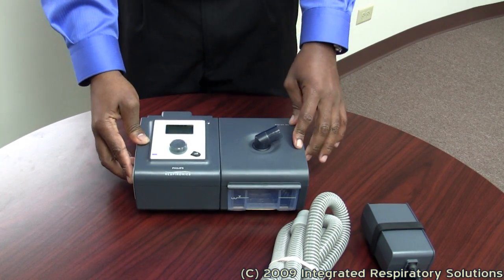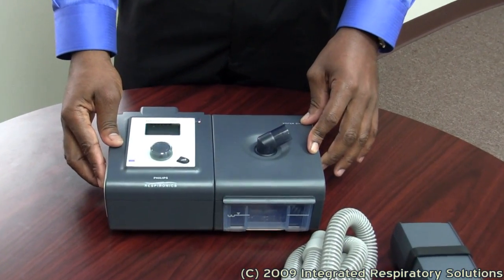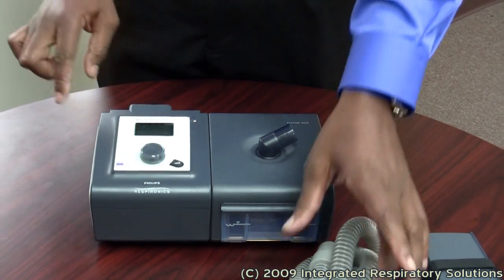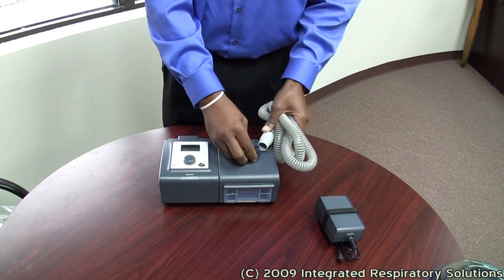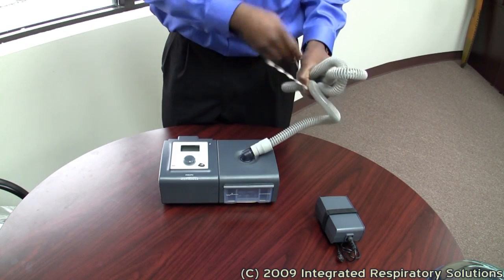There are three main manufacturers of CPAP devices: Respironics, ResMed, and Fisher & Paykel. This is a Respironics device. Your CPAP tubing is often connected to the humidifier — not the chamber, but the humidifier.